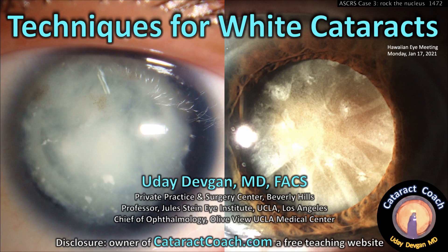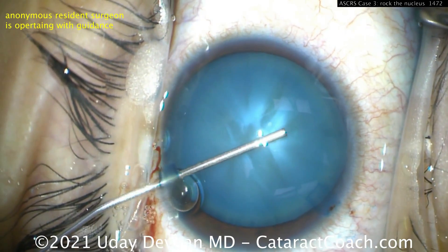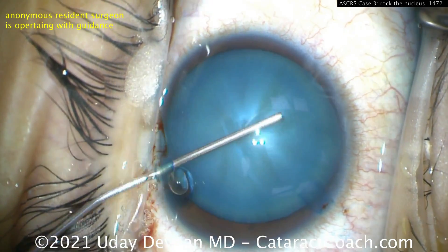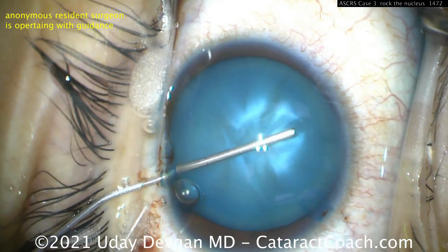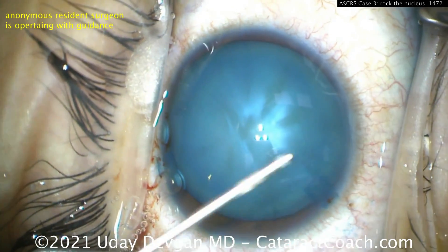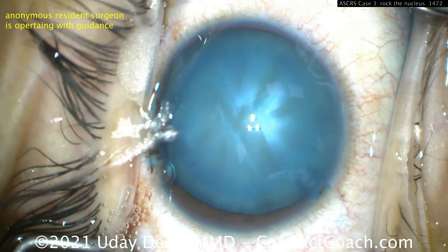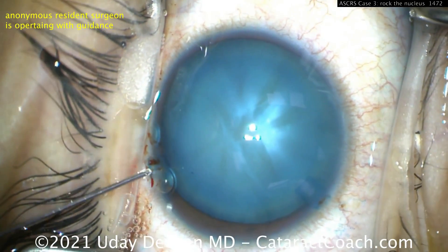We talked about white cataracts, and there are a lot of techniques we want to use here. The important thing to remember on these white cataracts is it's intumescent fluid. Look at this pressurized lens — you can see how much pressure there is within the capsule bag. That's a high intralenticular pressure.